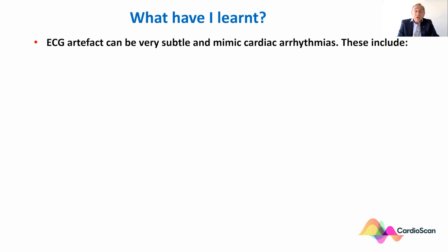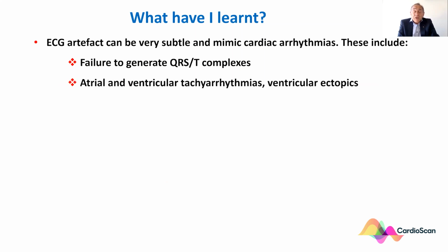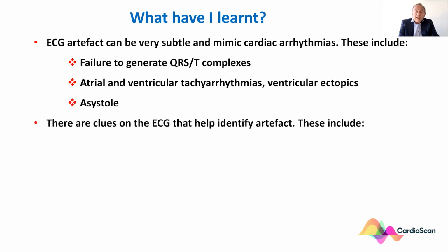So what have I learnt? An ECG artifact can be very subtle and mimic cardiac arrhythmias. These can be a failure to generate QRS and T-wave complexes, atrial and ventricular tachyarrhythmias or ventricular ectopics, asystole, and there are clues on the ECG that help identify artifact.